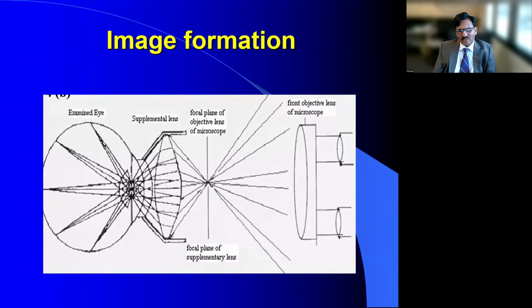And remember, this is not two-dimensional, it is three-dimensional. That means you have 12 meridians. So you have to examine various areas to understand the mechanical forces that are causing the pathology. And unless you visualize them properly, you can't really deliver the necessary dissection to accomplish your surgical goals. Added to the complexity, your vitreous is acellular, avascular, and has no color. So the dynamic movements are what allow you to perceive various aspects of the pathology, so that as a surgeon, you can take care of whatever is necessary to fix the problem.